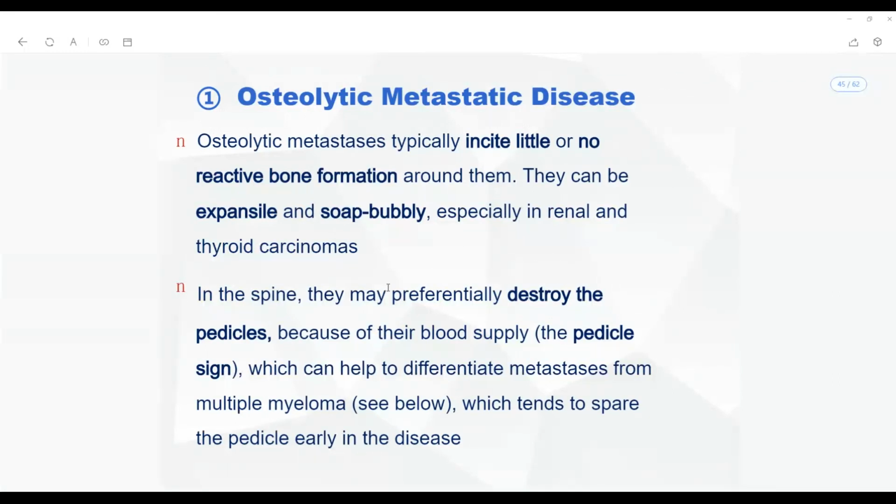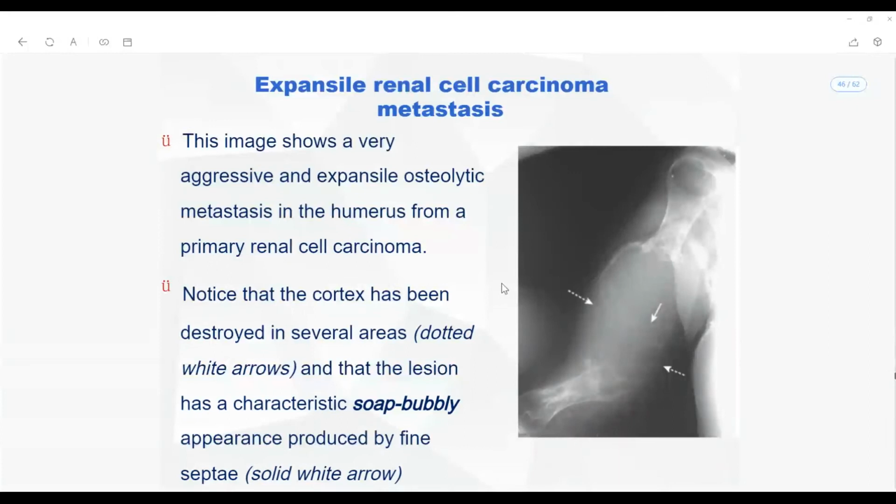Okay, when I pass over the pathological slides, you will try to understand. Yeah, we will show the pictures. Just wait, I'll show you. Okay, right. So first, let's try to understand one thing here. Okay, we will start with simple appearances.